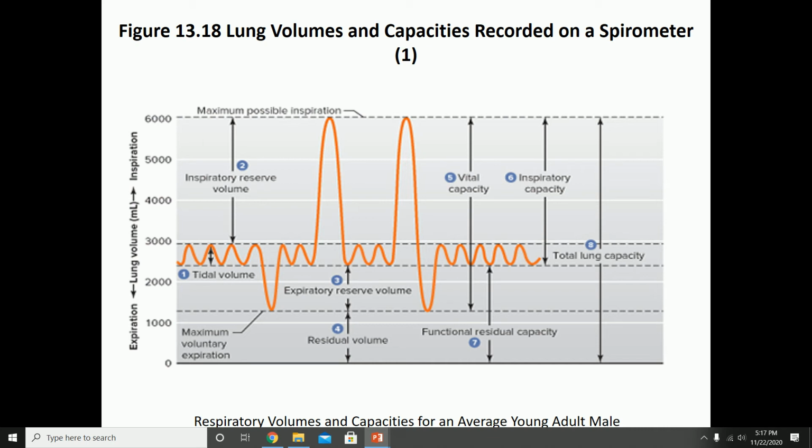So for the vital capacity, you ask the patient to inhale as much as possible and then exhale. You want to think of it kind of like taking a deep breath in and then blowing out candles. Okay, so deep breath in, then you blow out the candles, and you keep on blowing as hard as possible. So again, inspiratory reserve plus tidal volume plus the expiratory reserve volume. Those three together make up your vital capacity, and that again is what we use to diagnose and to track the progress of respiratory patients.